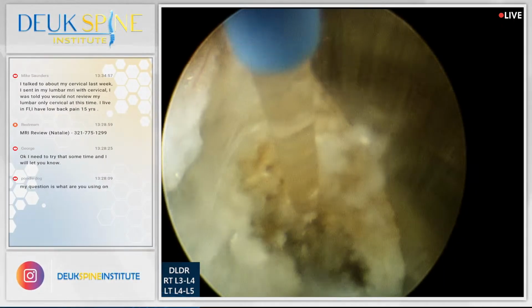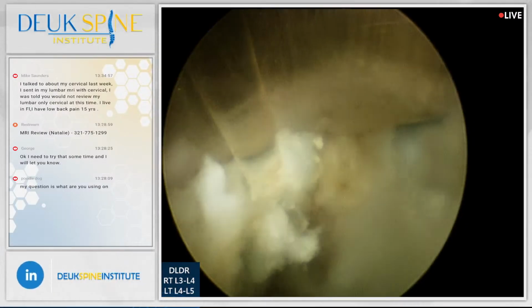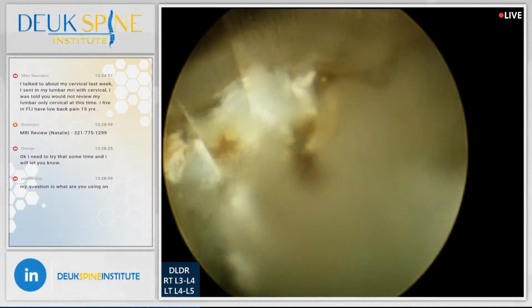We're just about done. We're going to be done in 10 seconds. Don't change it. I guess you already spiked it, right? So go ahead and change it. That's fine. Thank you. Good job.